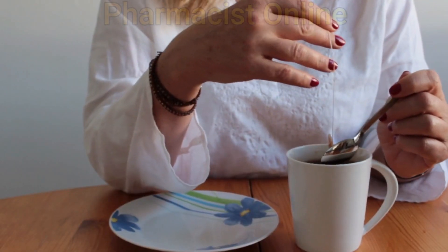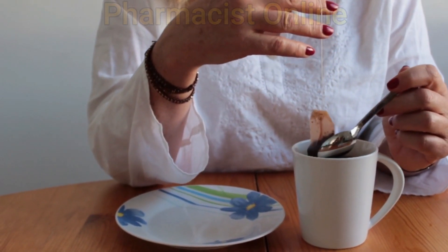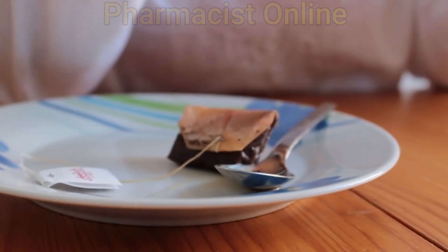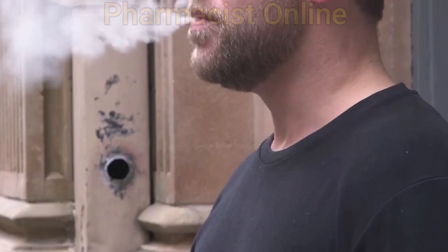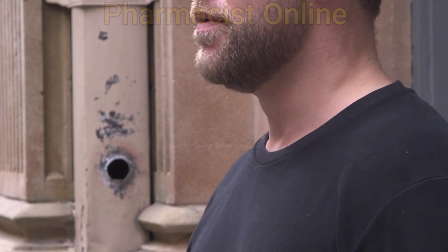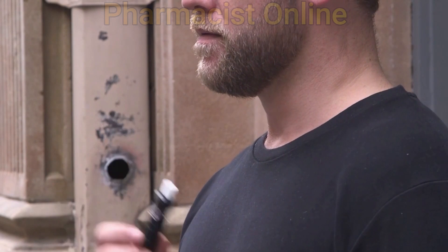Drinking coffee, tea, or caffeine-containing drinks can increase BP and you will get high BP readings. Smoking a cigarette, or even nicotine-containing products, can increase blood pressure and you will get high BP readings.